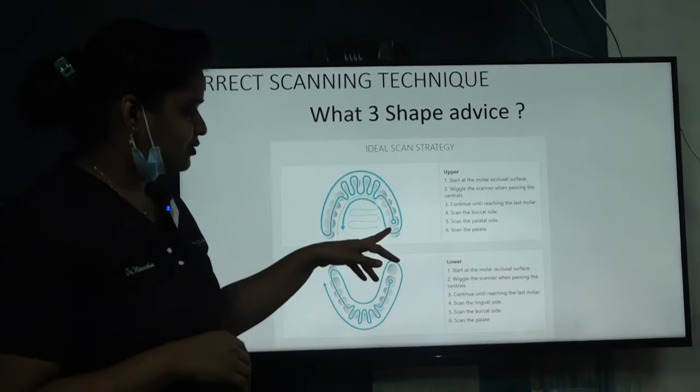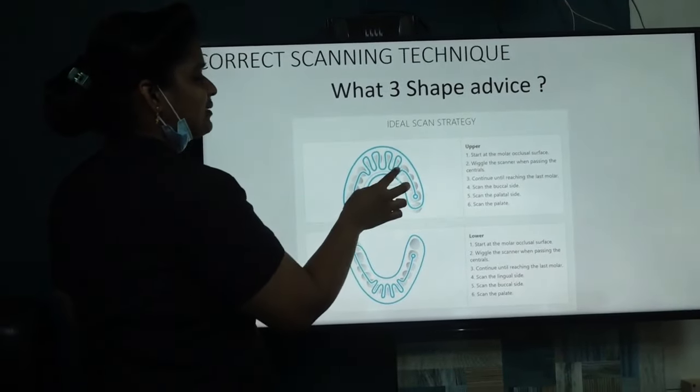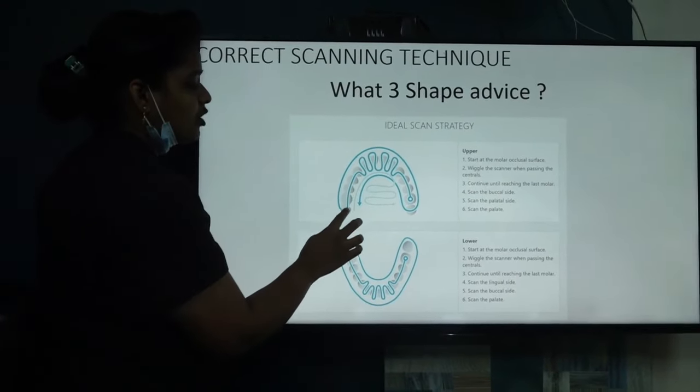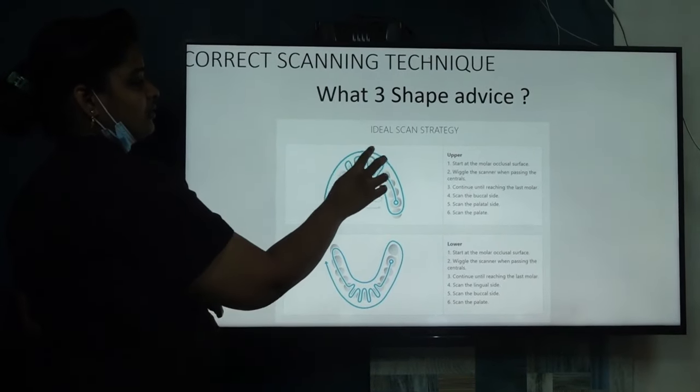For the upper arch, we have to start from the occlusal surface of the molars. Then we have to angle the scanner when passing the centrals. Continue until reaching the opposite side molars. Then you can go buccally, like this.